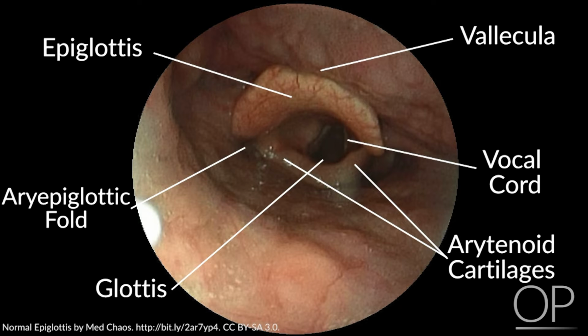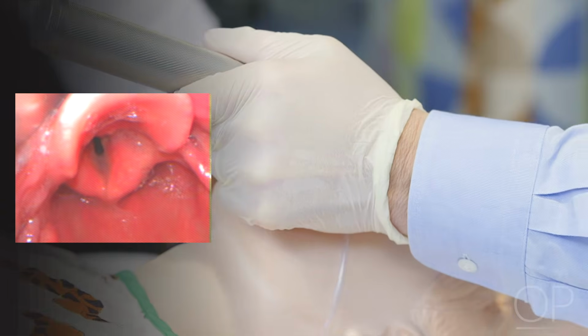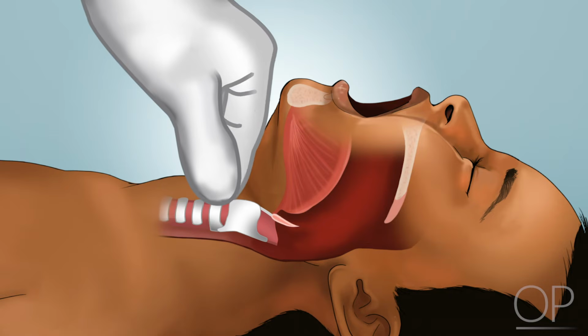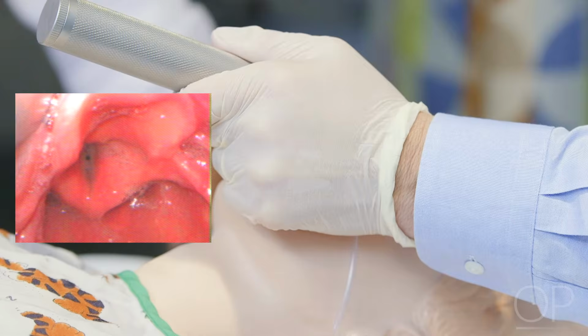Visualized anatomic landmarks can be used to guide laryngoscope position to visualize the glottic opening. Adjustments can be made to the laryngoscope insertion depth or the force being applied to the laryngoscope handle to improve visualization. Providers may choose to apply a gentle downward pressure externally to the larynx to improve visualization of the glottic opening. It is often helpful for the intubator to announce recognized anatomic landmarks such as the epiglottis, posterior cartilages, and vocal cords as they are visualized.